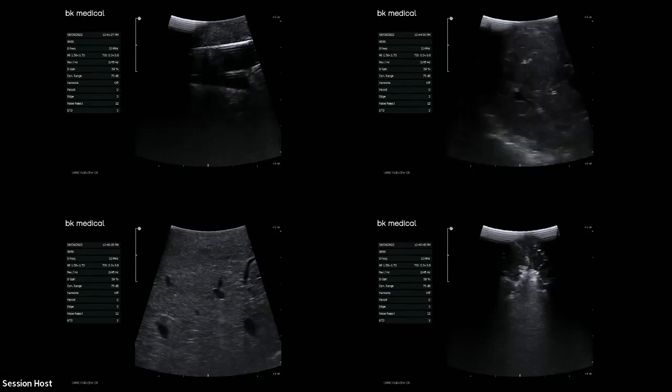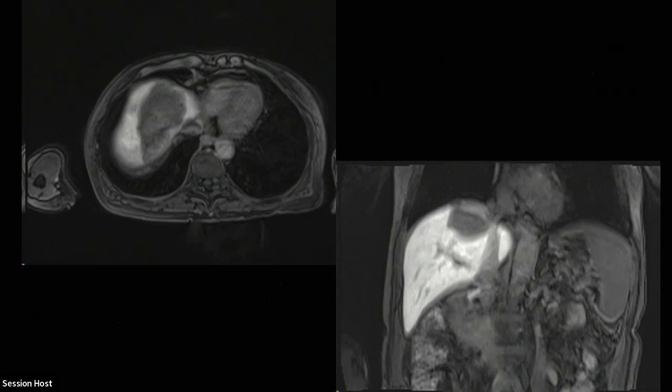I should have maybe done this in reverse because I'm showing this and then my last one. So you can see we did a pretty big burn, and I was joking with some of the people that came through our station that Dr. Iannini is very passionate about the fact that surgeons are better at burning things than interventional radiologists. I think one of the reasons is we're just more aggressive. So you can see that's not a small burn for the type 2 we did.